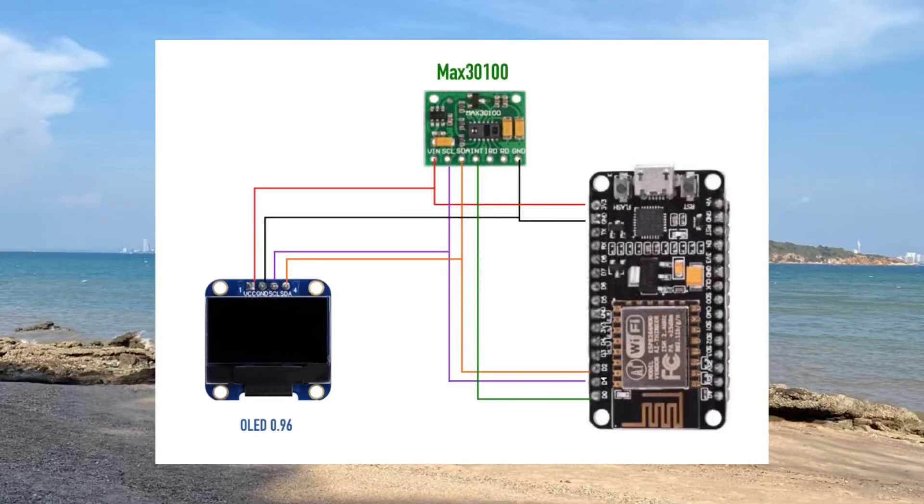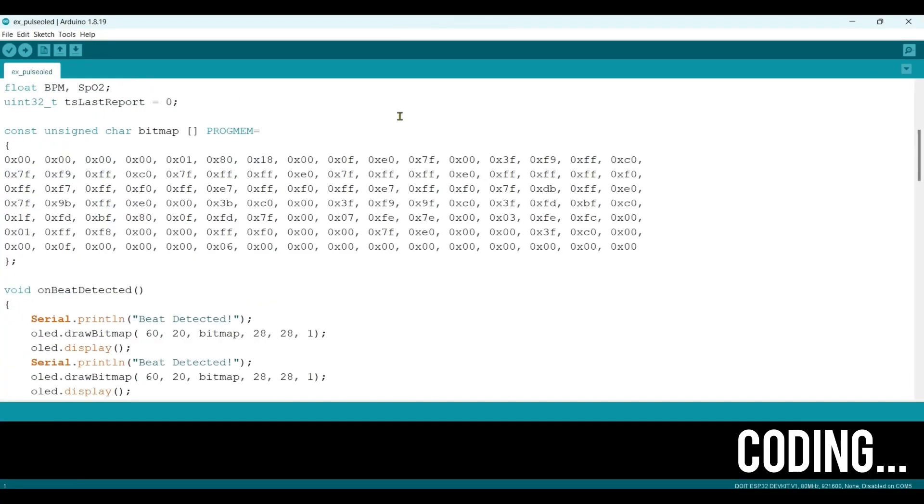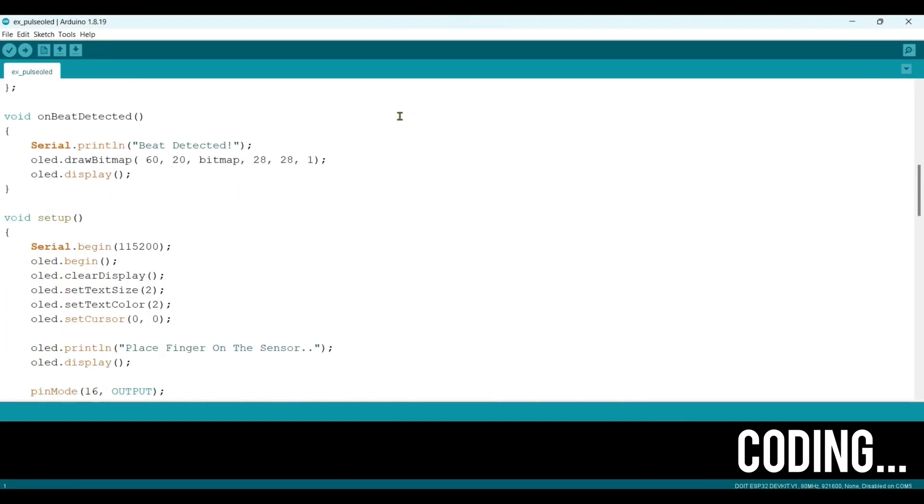Another way to do the pulse oximeter: in this circuit diagram, we add OLED. It immediately shows data on the screen.